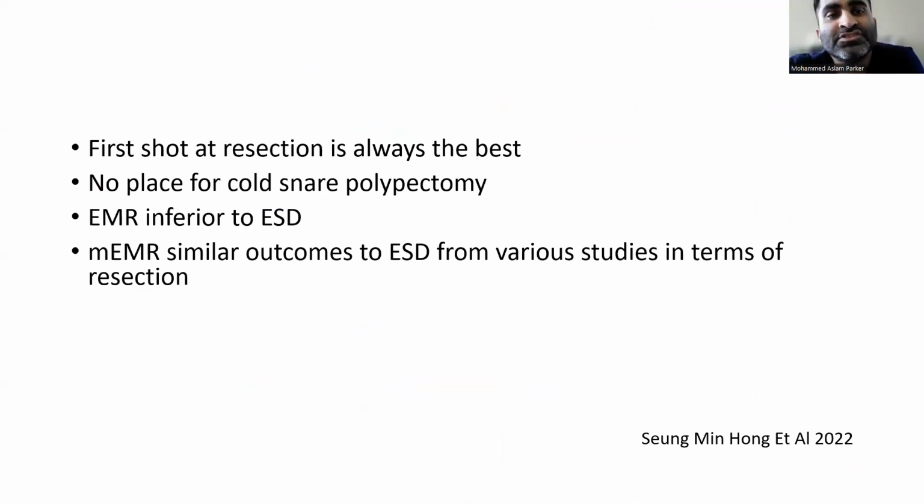So your first shot at resection is always the best shot. There's no real place for cold snare polypectomy. EMR is inferior to ESD. Modified EMR has similar outcomes to ESD from various studies in terms of resection. Over and under treatment is the big issue.